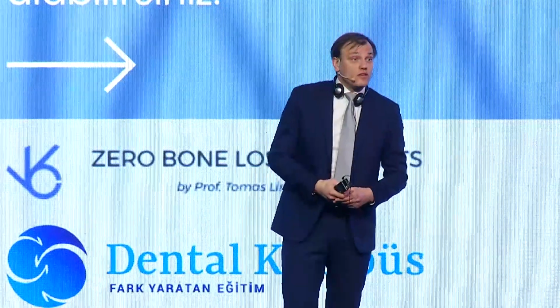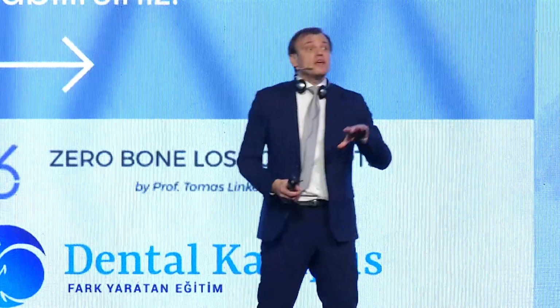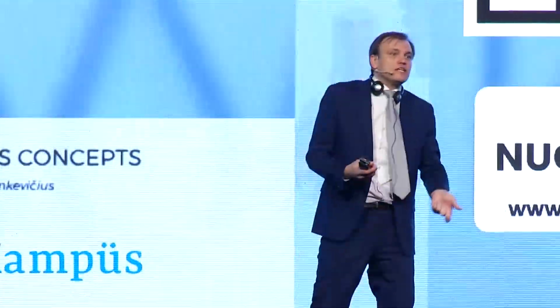Very good question, thank you. It depends, first of all, on whether it is immediate or delayed. In delayed, I would say 5 millimeters is the top. If it's more, you need to cut it off for two reasons. One is that it's very inconvenient to work: taking impressions, and it always bleeds, so you always need to anesthetize the patient.